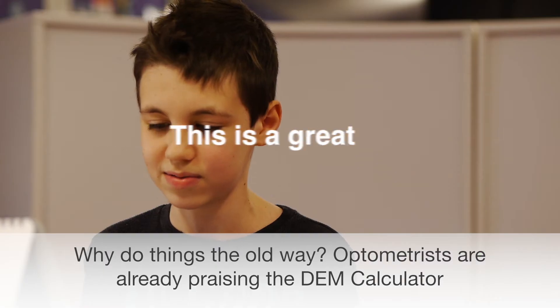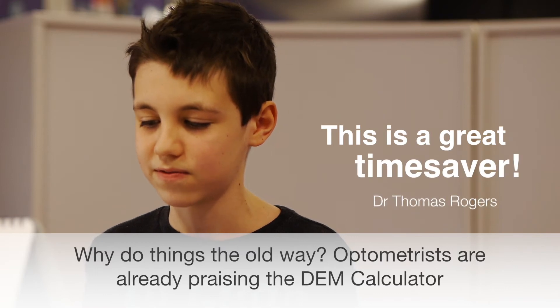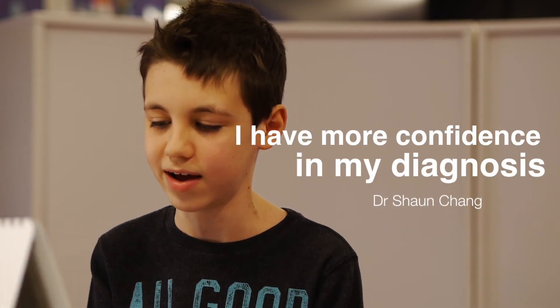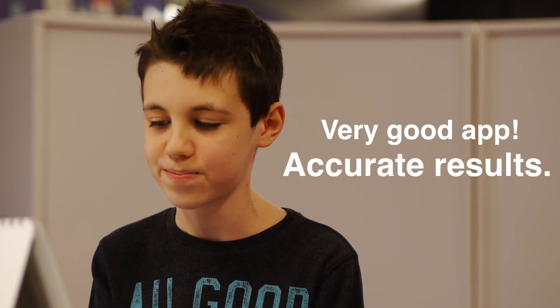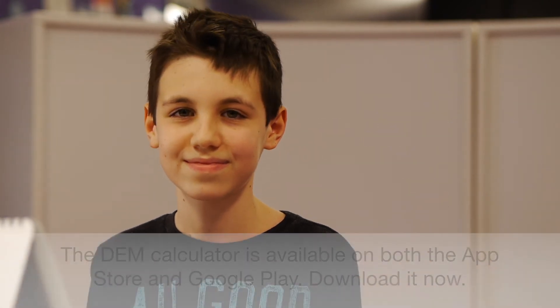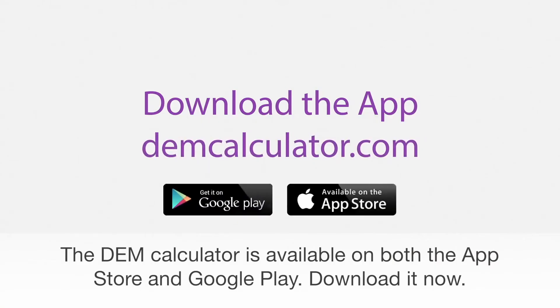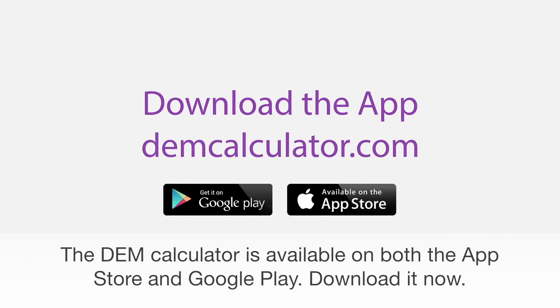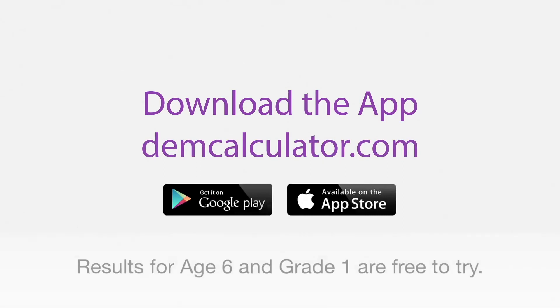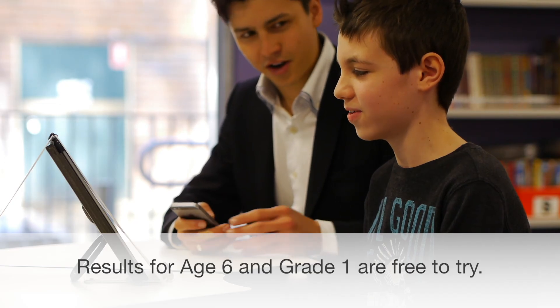Why do things the old way? Optometrists are already praising the DEM Calculator. The DEM Calculator is available on both the App Store and Google Play. Download it now — results for age six and grade one are free to try.